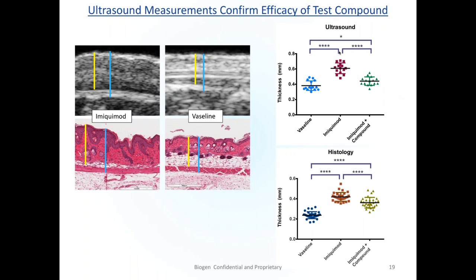Great. Okay, thanks. I was wondering if you could comment, as you did generally in the presentation, but more specifically, on the in vivo versus histology. I really like the juxtaposition of the ultrasound images with these pathology images. It outlines things nicely, but could you comment on the in vivo aspect versus the histology aspect and the pros and cons of each?